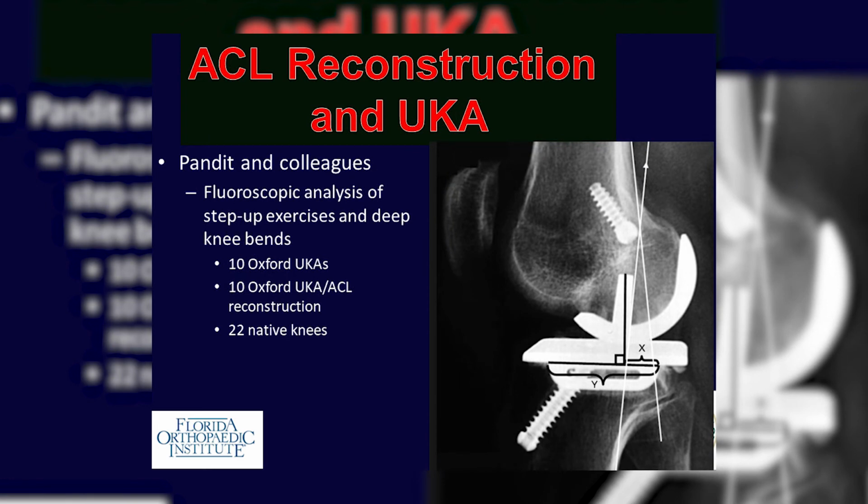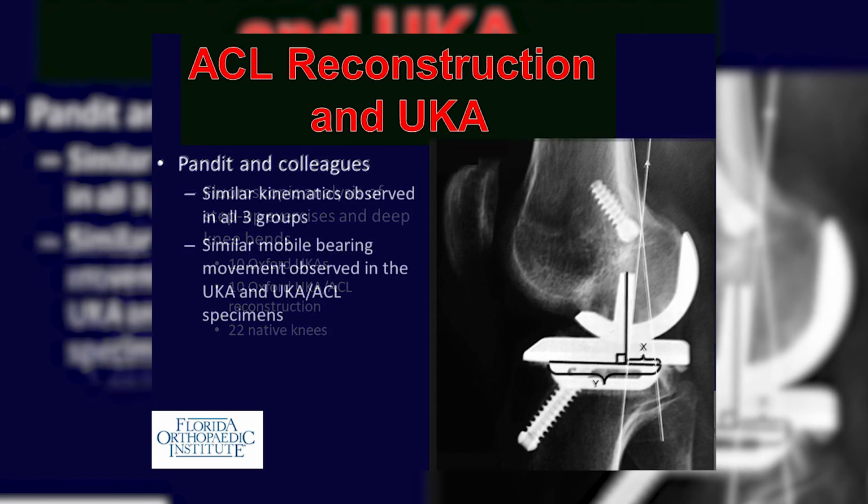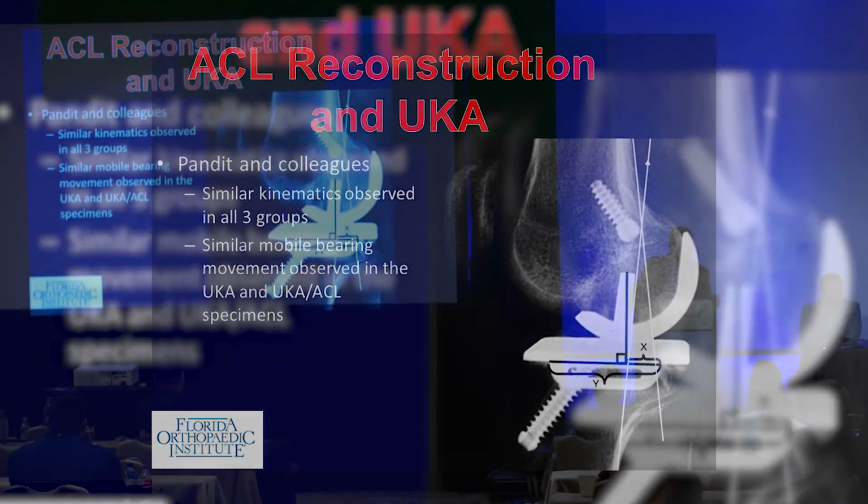This is a fluoroscopic analysis published by Pandit and colleagues evaluating partial knee arthroplasty with concomitant ACL reconstruction. I think the important point here is that it returned the knee kinematics to simulate the native knee with a partial knee and ACL reconstruction. So it's really rather impressive that with these types of procedures you can restore the native knee kinematics fairly well.